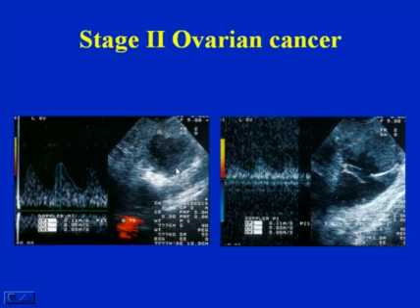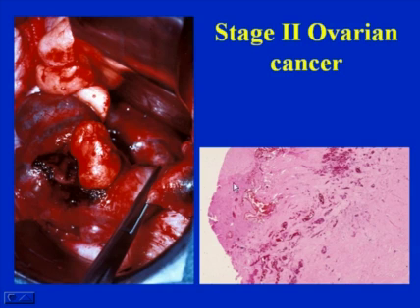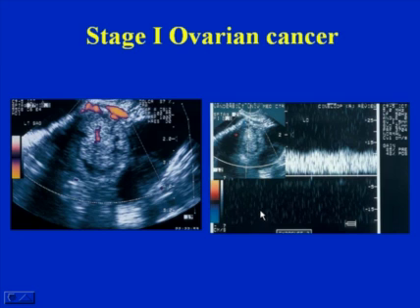This was one of the first cancers we found. This is about a 2 by 3 centimeter ovary with an irregular solid area. Based on morphology, of course, one would be concerned about this lesion. And we could see that it extended into the fallopian tube on the left here. And here's the operative specimen with the tube clamped by the hemostat. And in low power microscopy, you can see that these are all very abnormal vessels surrounding the epithelial ovarian cancer.